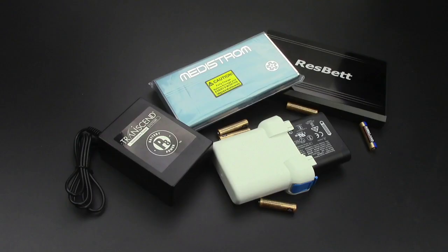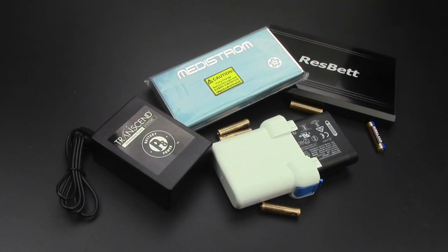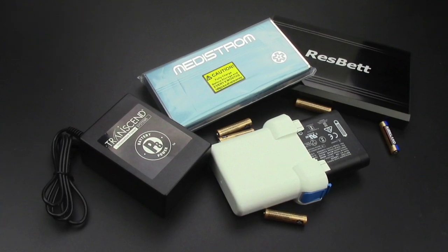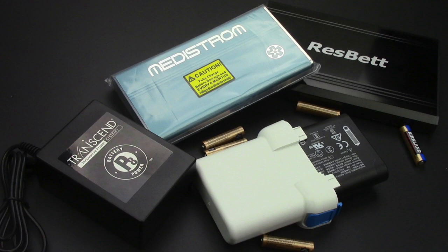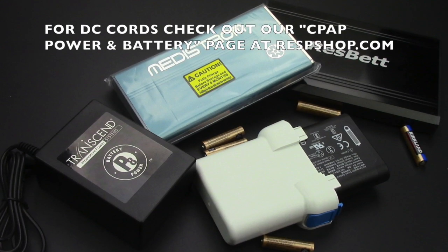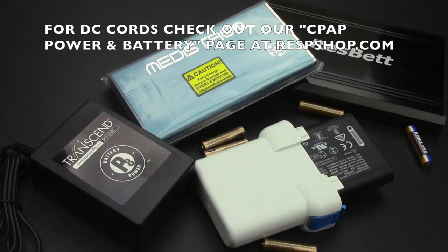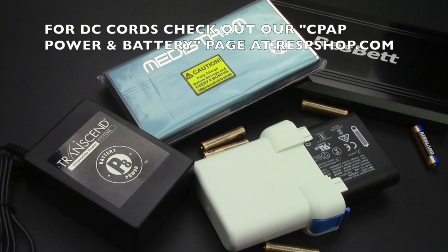With that being said, it's definitely a different story when it comes to the batteries, and there are a lot more variables that you have to take into account that we'll be going over. One common scenario is when you want to plug into a camper or a vehicle. Something more familiar would be the cigarette outlet of a vehicle. More likely than not, that's going to be a standard 12 volt DC outlet, and the majority of CPAP machines are going to be 12 volt.